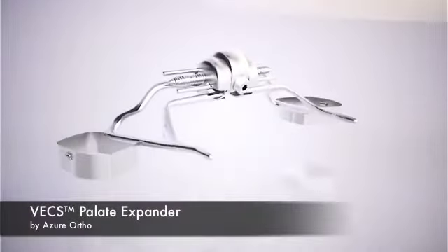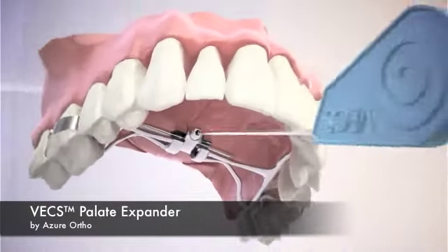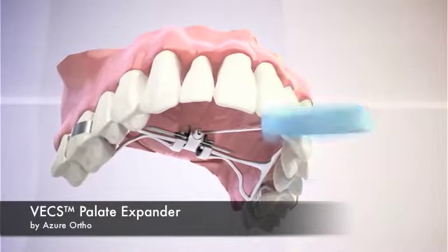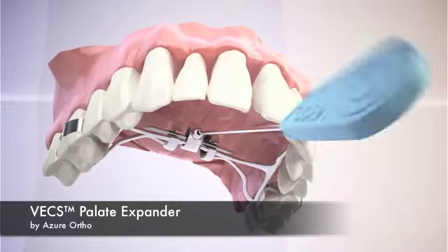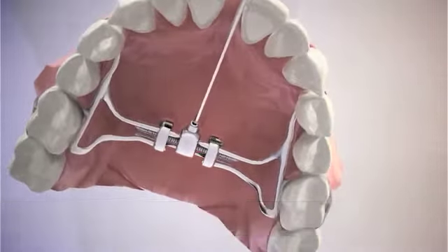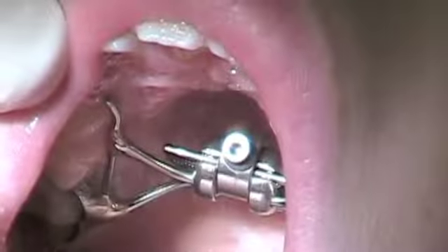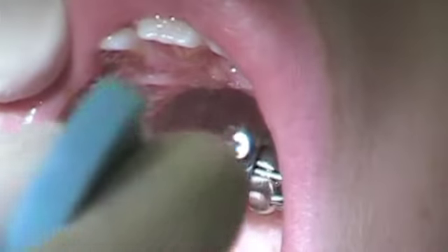Once the palate expander is cemented, your orthodontist will give you instructions for how often the expander needs to be activated. You will need to activate the expander yourself or have somebody else turn it for you. An activation key will be given to you along with the instructions for use. To properly activate the expander, simply insert the ball end of the activation key into the activation screw head, located at the front of the expander.